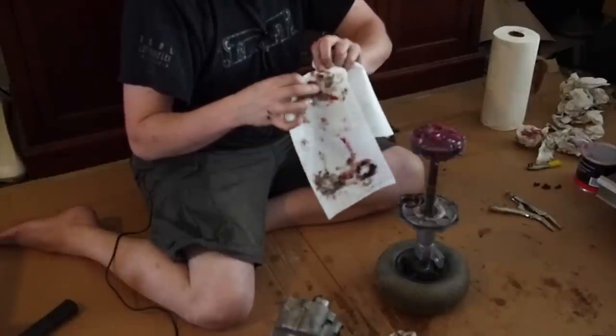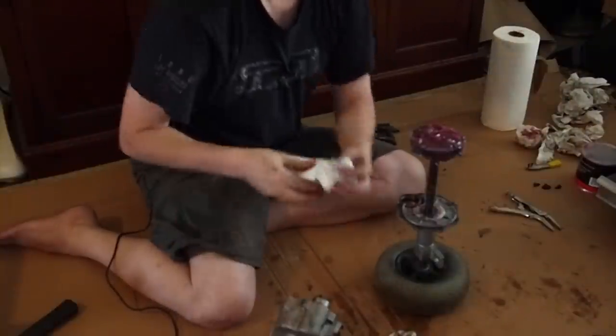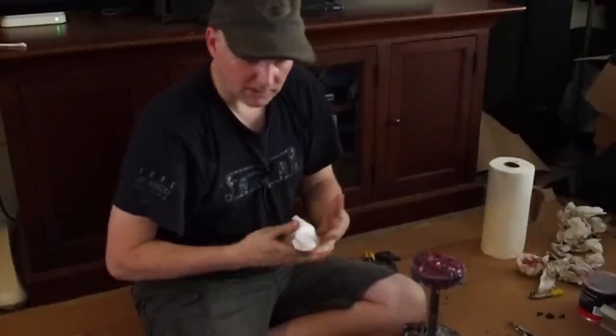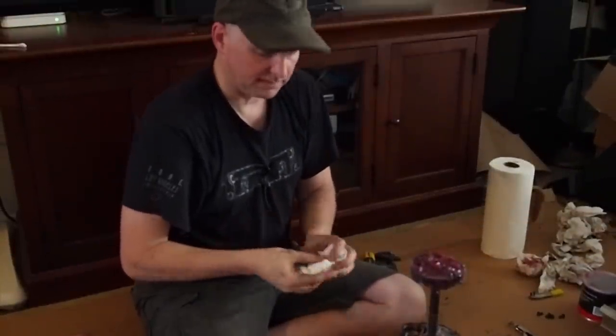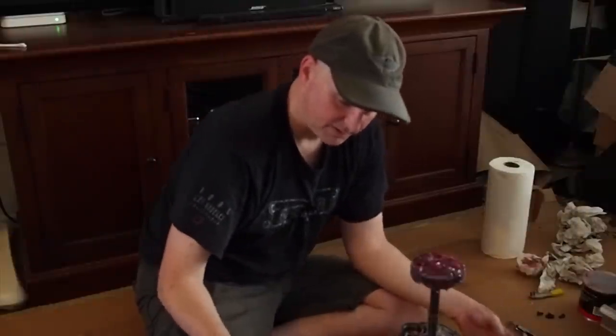Well, I don't feel a whole lot, so that's okay. That's just the grease breaking down. But there's got to be some metal in there too, which is why it turns brown. But I don't feel like chips or anything like that. And I do believe that it did wear down over time.